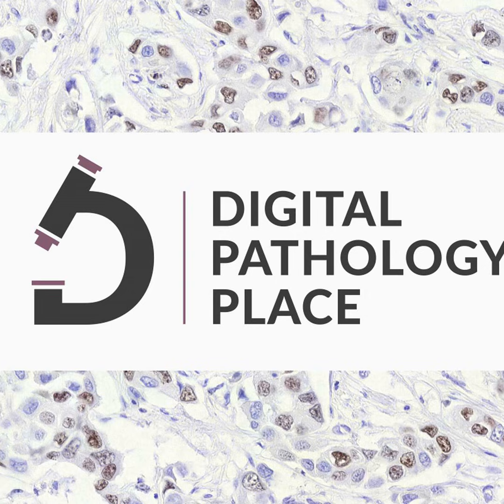So the context really matters. And when you think about the checkerboard relative to tissue, you can get really complex, heterogeneous expression in a tissue. That's a really challenging problem for a pathologist, visually scoring. There's an interesting paper as well by a colleague of mine, Famke Effner, where she explains the ground truth paradox, especially in this area of visual illusions, of color perception. And this is where computers are a lot better at doing this.